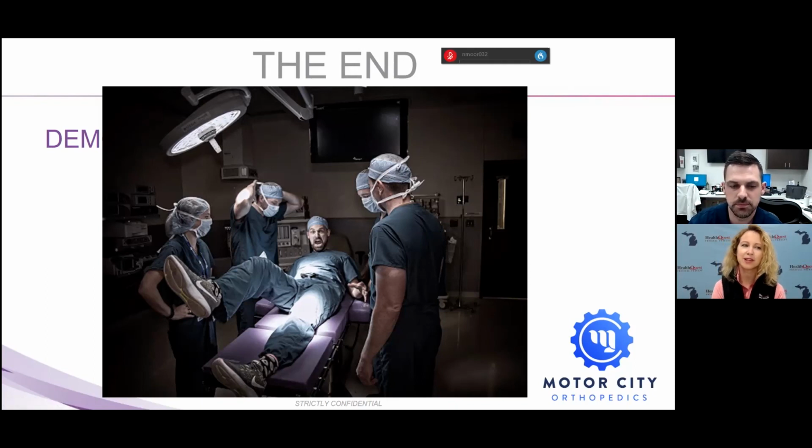Right. So from your perspective, is there an ideal person for this procedure, speaking to physical therapists or to the general public? Who is best for this procedure? I think it's anyone that has carpal tunnel. Again, when we do the diagnostic scan, we're going to make sure they don't have some abnormal variant of the recurrent motor branch or something like that that would preclude them. But for the most part, there's more things that are going to preclude you from a medical standpoint from getting surgery than from doing a local only procedure. So it's not like anyone's really better or worse.